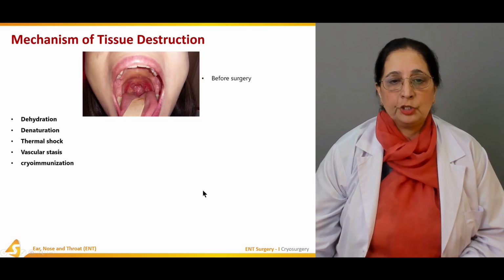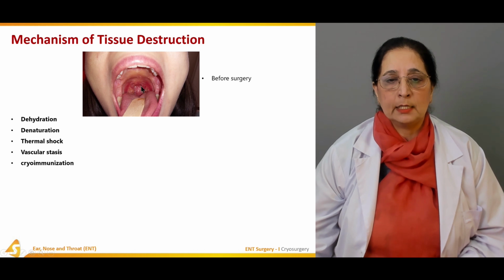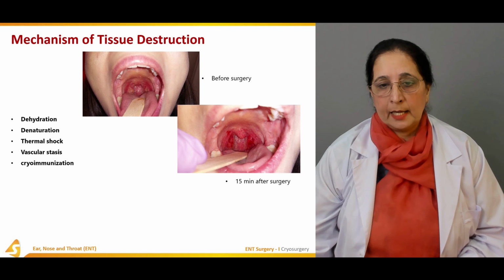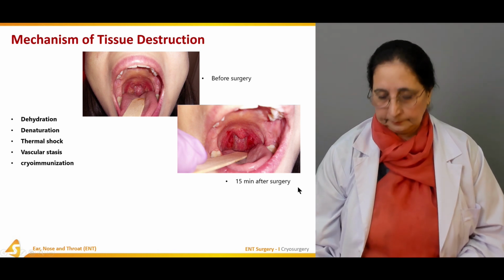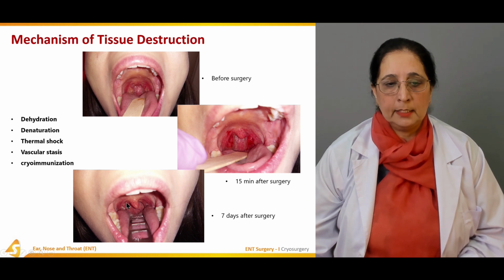This is the picture before the surgery, before the cryosurgery procedure is applied. Then 15 minutes after the surgery, and then this is 7 days after the surgery.